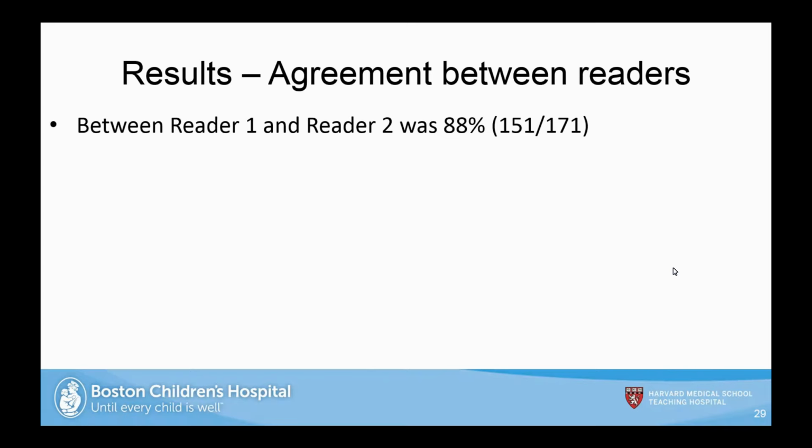I think if they wanted to have borderline cases, they'd have to have the readers agree on which ones are non-diagnostic and diagnostic. I think that's the fundamental thing: if they don't agree, then just throw that case away. Find cases where they actually do agree, and then use that data to train the algorithm. I suspect they'd have to do that again.